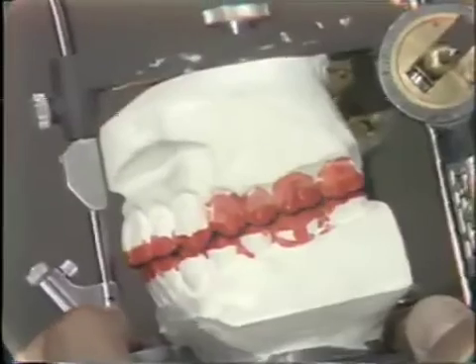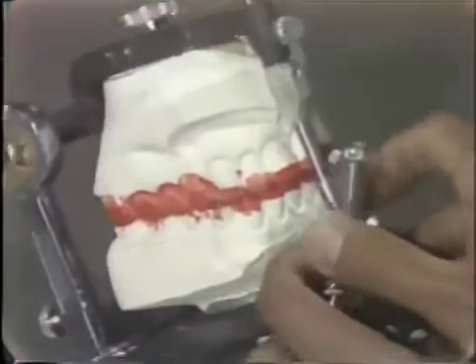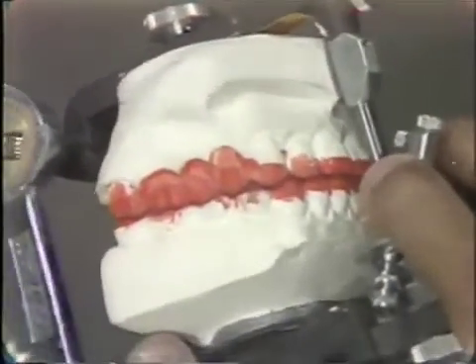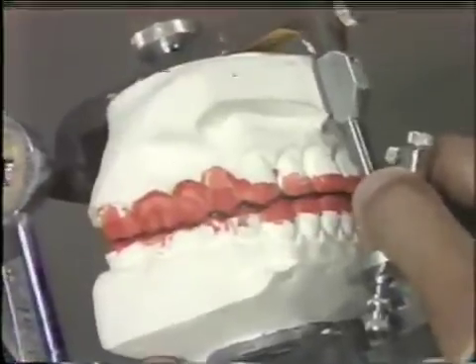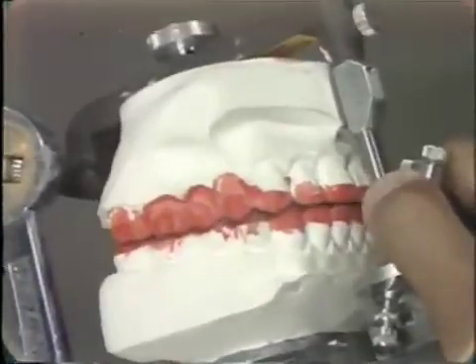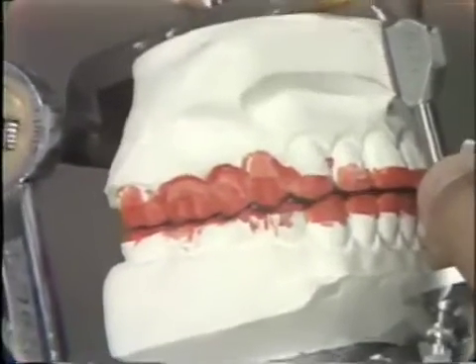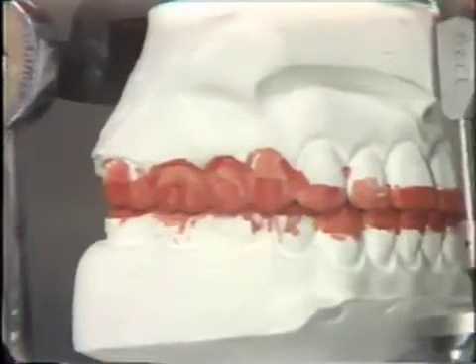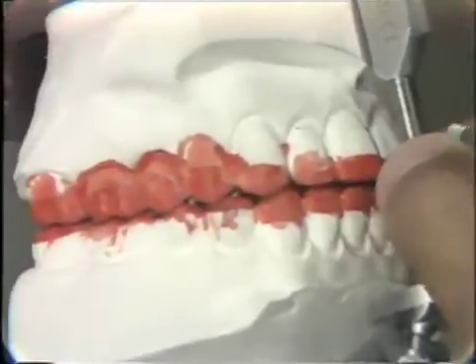This excursion communicates the feeling that there is no balancing contact. If we go to the other side and perform the excursion — I'm tilting this up to show the space developed between the teeth — in this excursion it's more difficult. You can probably hear a clunk as I go into excursion in this direction, and this is due to the fact that there are some interferences present that will not allow a smooth, even excursion.